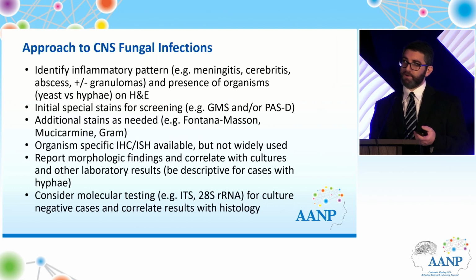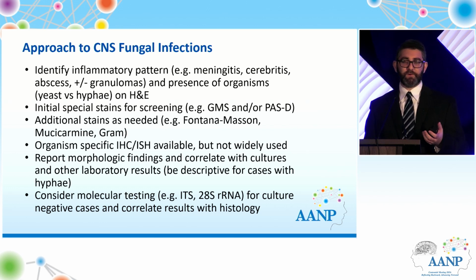So this is our overall approach to fungal infections. You look, again, at the inflammatory pattern. You can almost always, but not always, see fungi on an H&E stain if you look carefully. But there's always more when you look on the silver stain or the PASD, whichever is your favorite stain. I usually end up ordering both because there's some organisms that for whatever reason work better or worse with one stain. And again, you want to get this done sooner rather than later, so I'm in favor of just ordering both.